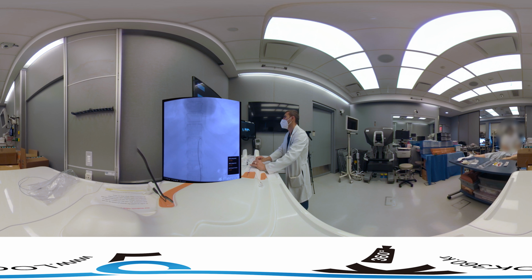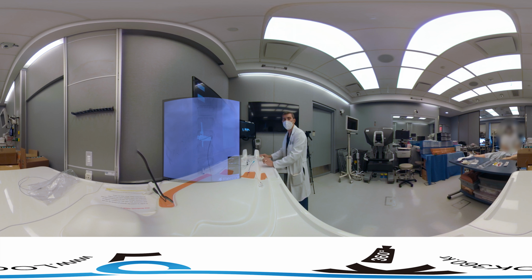And we're going to access the celiac trunk right around here. So you're going to pull back just a little bit. Right there you can see we've selected the celiac trunk. That's the splenic. Alright, so we're going to turn our catheter slightly, and there we go, that's the common hepatic artery, which we're going to get into here with our catheter. On injection here, you're going to see the hepatic arteries. We're in the proper, and you can see the tumor outlining here on the screen right there. So we're going to pull our wire out, and we're going to get ready for the second part.